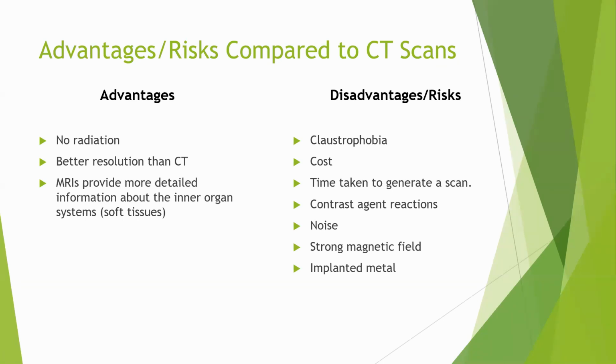Now, you can do a standing MR or an open gantry MR. I am not sure if it is present where you live, but I know it is present where I live. So you have standing MR and open gantry. Essentially it's like a U shape, and the patient can basically go in and see everything in front.